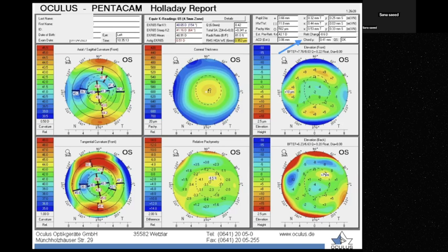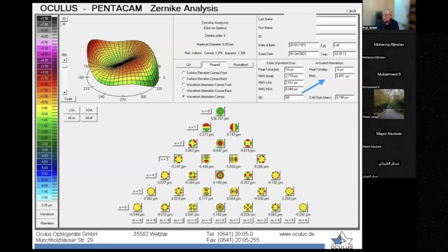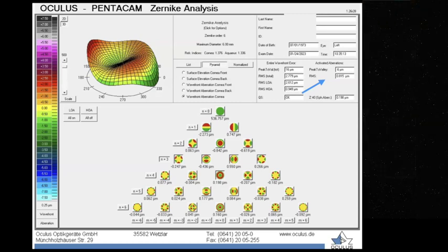Okay, place an answer. High order aberrations, we have seen them, this one and this one. What else? It seems that I'm going to ask one by one. So, Talat, what do you think? Oscar said refraction. Okay, good. Abdulaziz, radius of curvature, anterior chamber depth. Okay.